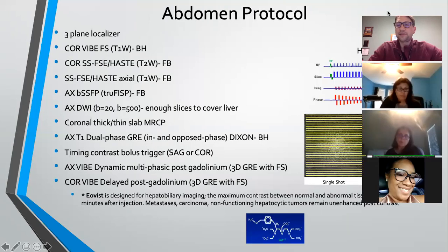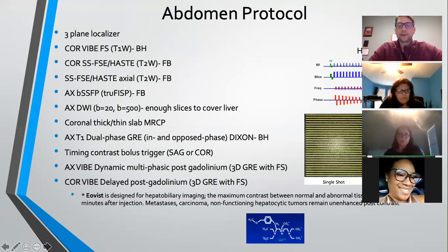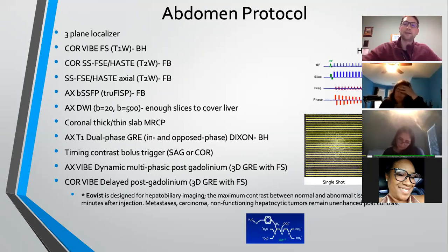Anybody do an EOVIST abdomen yet? I've seen them at St. Joe's. Okay. So long scans, right? Yeah, very long. We had to keep calling the radiologist. And he's like, 20 more minutes. And with that, they sometimes play it where they'll get the patient up, they'll do another scan in the meantime, and then they'll bring that patient back on the scanner and scan them like 30, 45 minutes later.